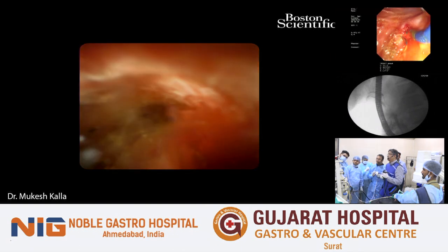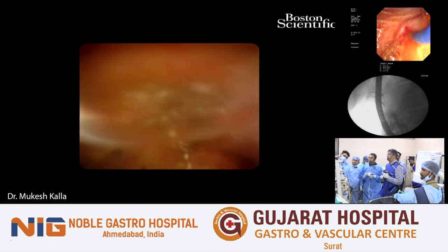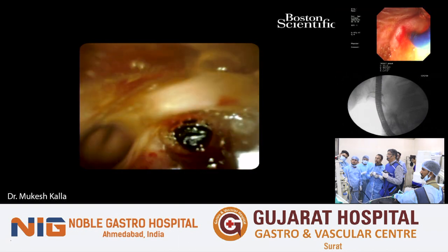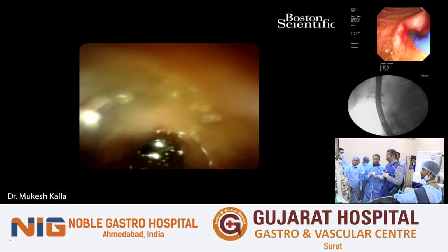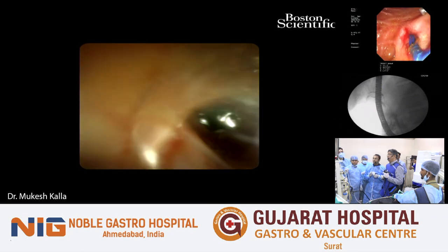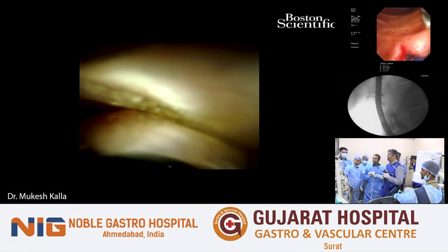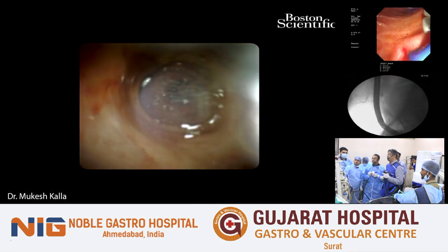Because it makes the task difficult. Yeah, like it does. So we will go in first to the hilum, ensure that we've reached and seen the common bile duct properly, then we'll come back. We'll explore the location of the cystic duct. And if we can go straight, we go straight with the cholangioscope itself. If we are not able to go straight, then we'll use a guide wire to negotiate the cholangioscope inside.